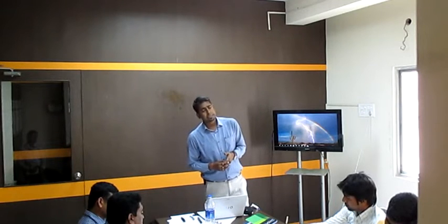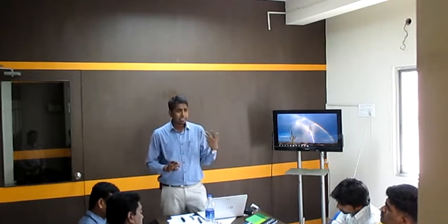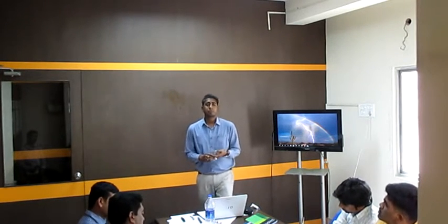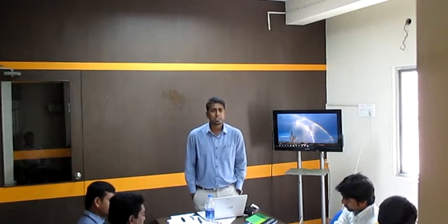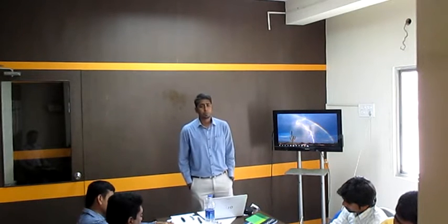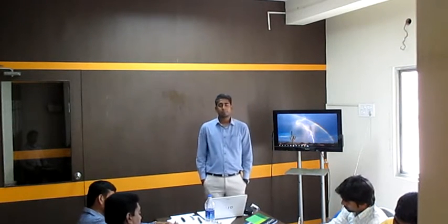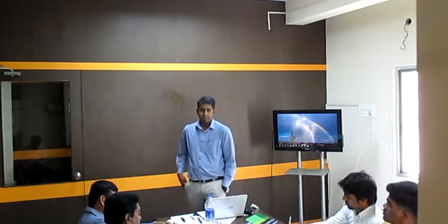Another classification comes on the basis of gear ratio. First one is 1:1. It is known as same ratio. Same ratio 1:1 is represented by blue color.